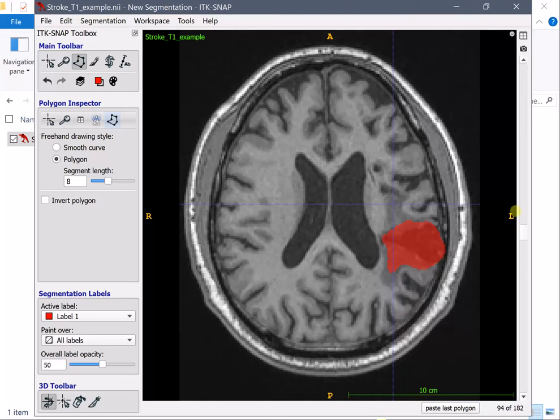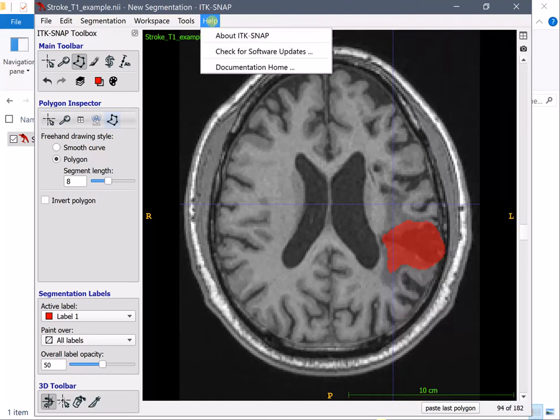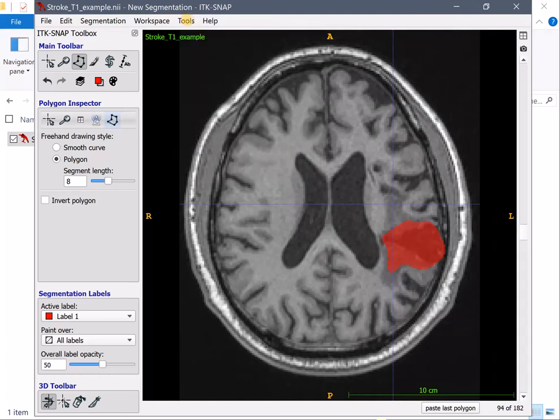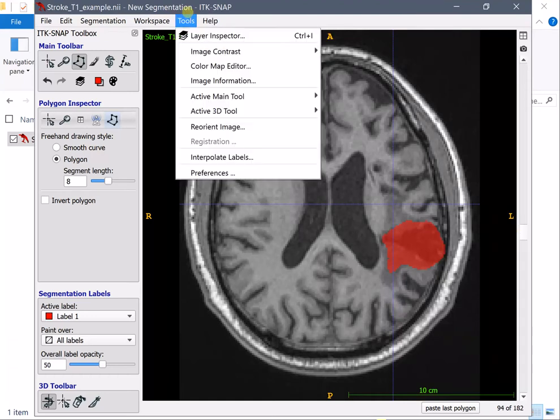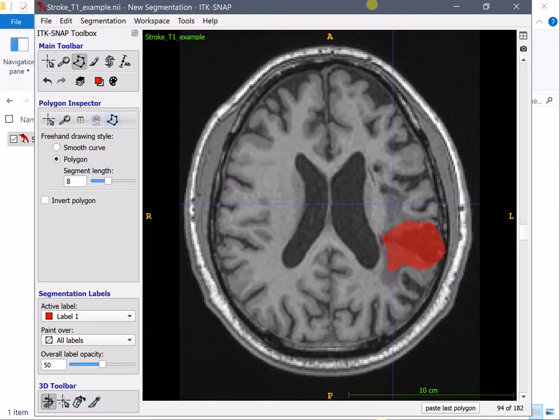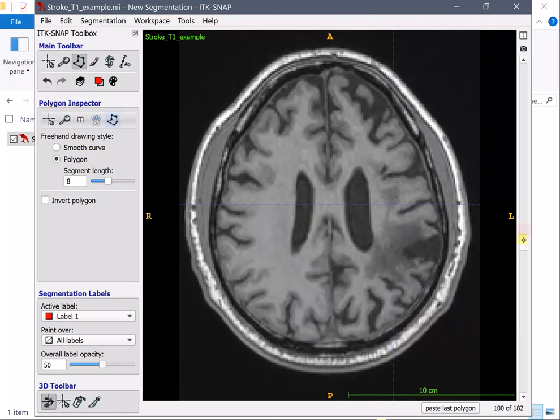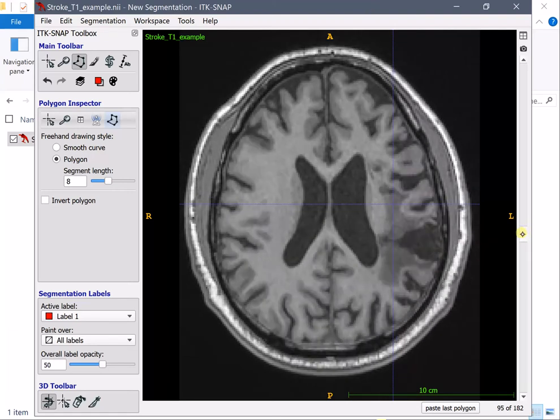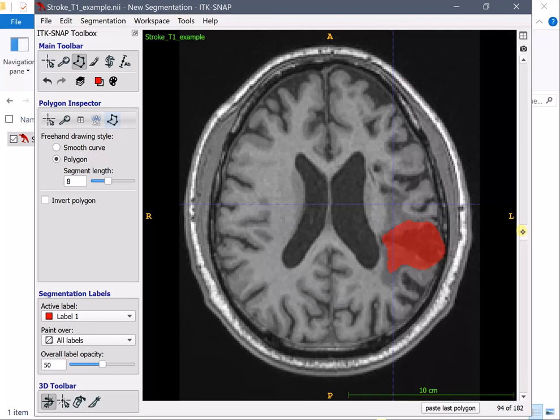Now ITK SNAP has a very interesting feature which can interpolate the segmentation which is this one here interpolate the labels in a specific plane. So what we're going to do is not draw on every slice but draw every few slices.